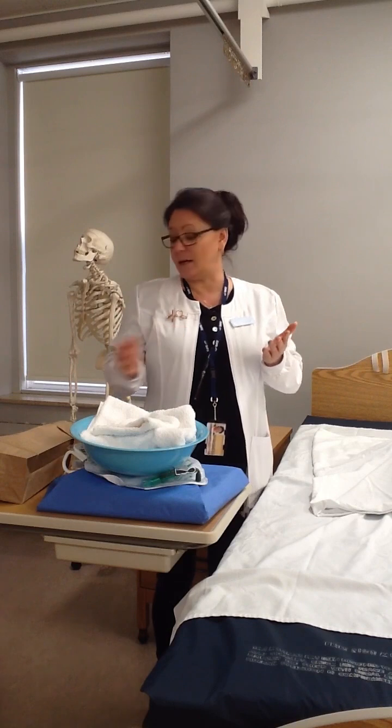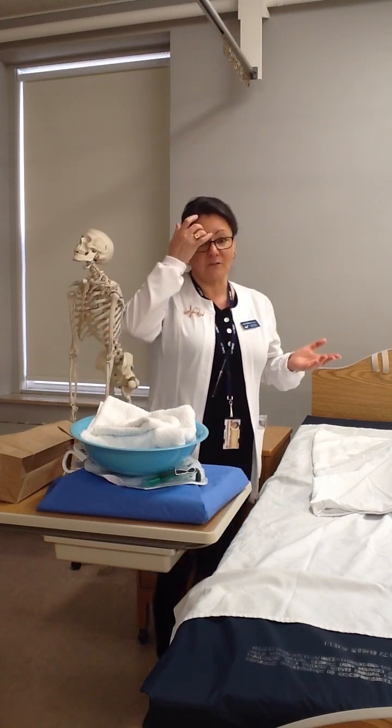I want to see if Jesse has any allergies to latex, for example, because most of our standard or typical catheters are latex. And if Jesse had an allergy to latex, I'd have to use a silicone catheter. And I would want to see why Jesse needs a catheter inserted. Maybe I'm just reinserting a new one. Maybe there are problems associated with Jesse's health right now and he needs one. I want to know why. So when I'm happy with all of that information and I've assessed all that I can from the chart and the doctor's order, now I'm ready to go and visit my patient and have a conversation about this procedure.